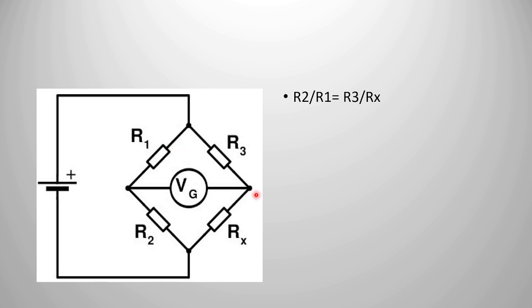The pressure transducer has a strain gauge type of pattern. It's a Wheatstone bridge principle, a physics principle. There are three known resistances and this one is an unknown resistance. When pressure is applied, resistance decreases in one area and increases in the other area, and current flows, the voltage flows, and that is transmitted to the monitor. Nowadays, all these strain gauges are present on all four arms. You only apply a pressure, resistance reduces on one side and increases on the other side, and there is a flow of current, and that is displayed on the monitor.